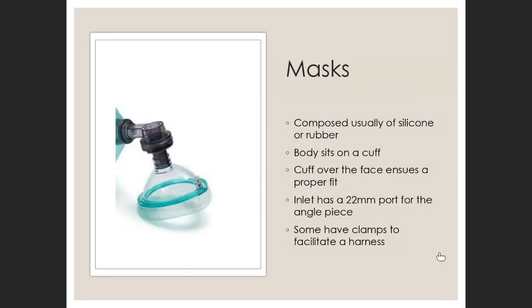Zeddy, laryngeal mask. Okay, Janelle, you just come. LMA. All right, Kavito. Laryngeal mask. All right, Karen. Yeah, I'd go with the laryngeal mask. Kimberly. Kimberly Harvey. Christina.